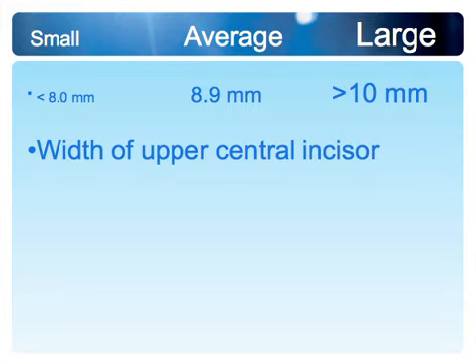Because having these large teeth and it being a contributor to the crowding, obviously I'm looking to develop proper arch form and proper arch width to hold those teeth. Do I have the right foundation to move them into the arch? So I'm a big fan of measuring those centrals and making sure we're on track to have the right foundation to expand for a proper arch form and proper arch width to accommodate the tooth size that presents itself.